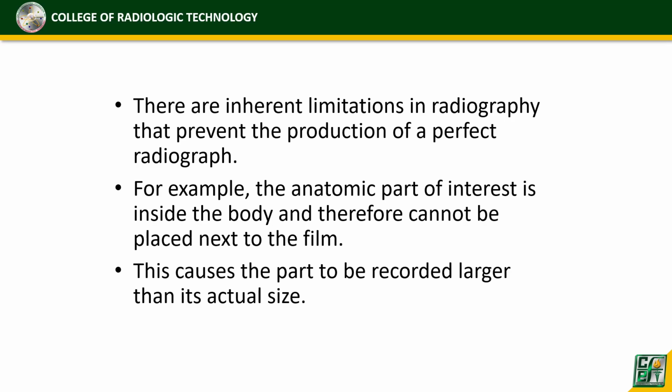Kasi nga, like, example, X-ray of the lungs, chest, di ba, of the lungs. So, hindi naman natin madidikit masyado yung lungs sa ating image receptors due to the anatomical structures na nasa pagitan ng lungs at ng ating image receptor. Such as the ribs, kapag PA, di ba, yung ribs, yung ating muscles. So, ganun din pag naman AP, yung ating scapula and etc. Yung vertebra, ribs pa rin sa mga muscles. So, yun yung ibig niyang sabihin. Hindi natin didikit masyado doon sa ating image receptor yung part to be examined. So this causes the part to be recorded larger than its actual size. So, nagkakaroon ng magnification.